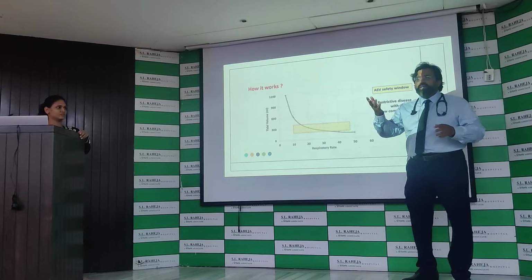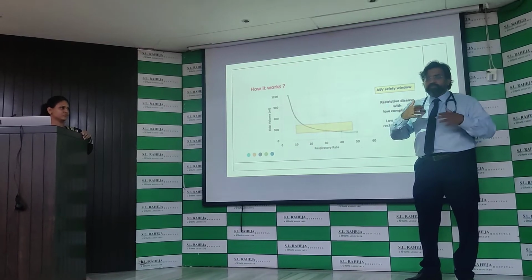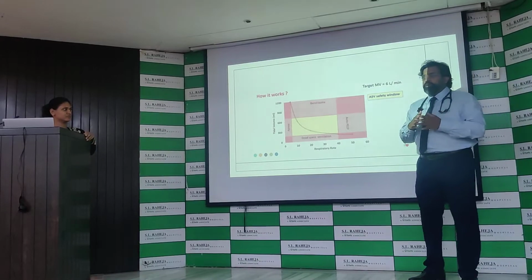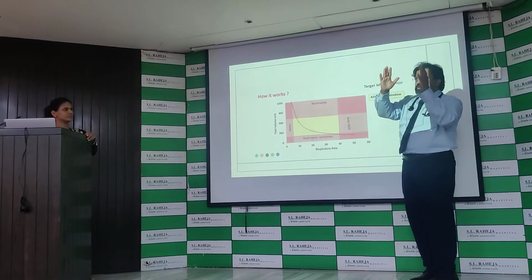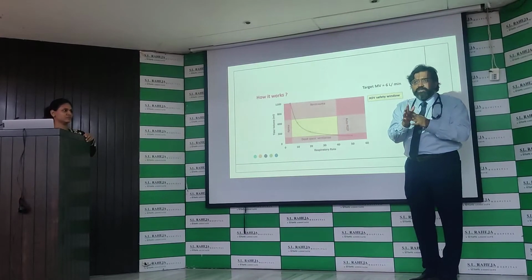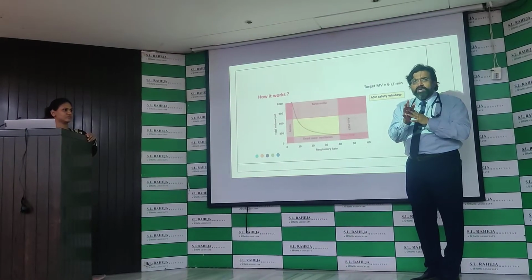Meanwhile, if a patient suddenly has bronchospasm, a tremendous bronchospasm, then what will happen? It will again go back to that obstructive window, and it will try to actually compensate for that. It will not allow this patient to be in a wrong zone.